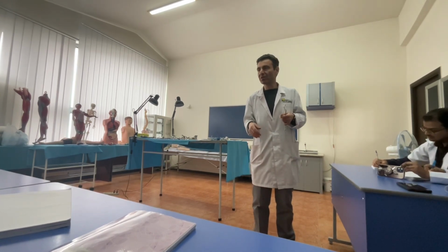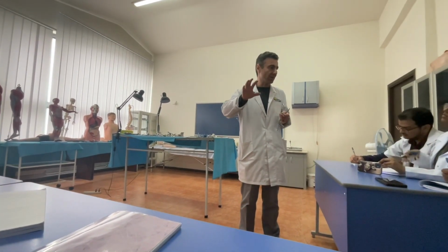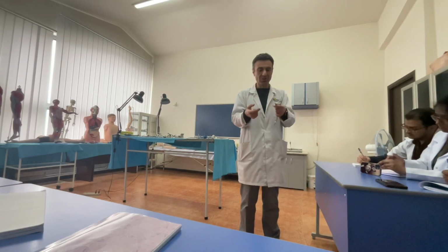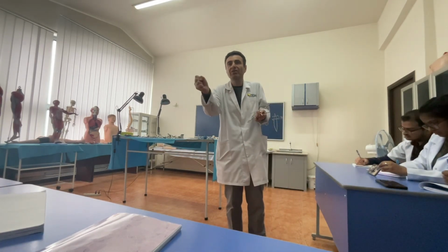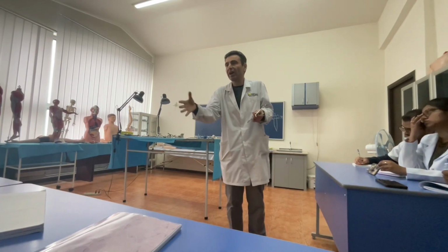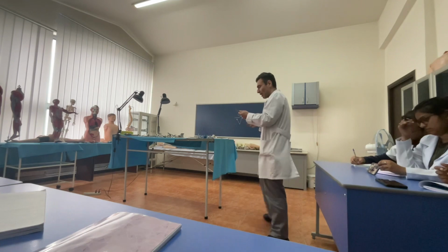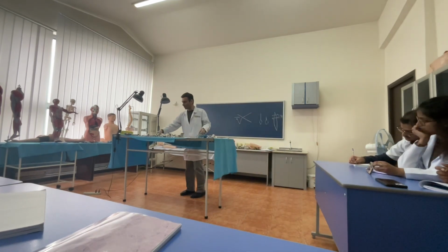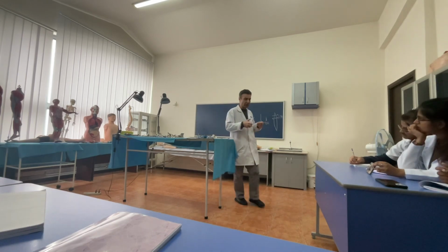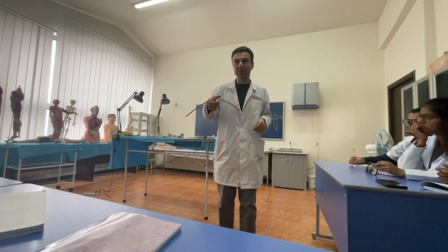Usually Pean's forceps are used in pediatric surgery because it's very gentle. It doesn't crush the tissues. Because you understand that grooves and teeth are created for better gripping, but at the same time, these are traumatic structures. They can crush the tissues. The teeth, of course, are for good gripping of structures, but they are not applied on the wall of the vessel. They are applied to the neighboring structures.